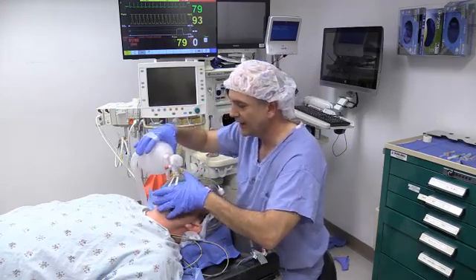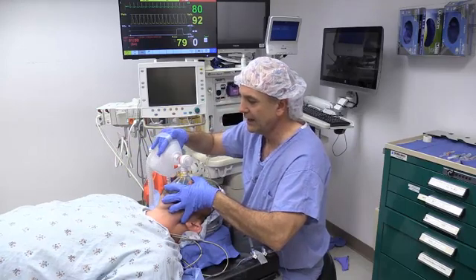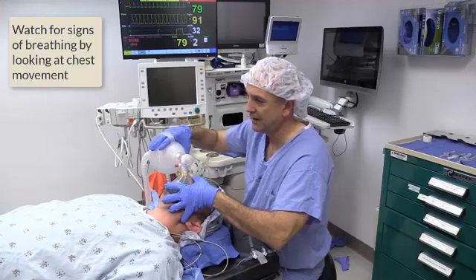I am then going to lift up on the angle of his mandible, and I'm going to go ahead and ventilate him. What I'm watching for is chest rise and fall.